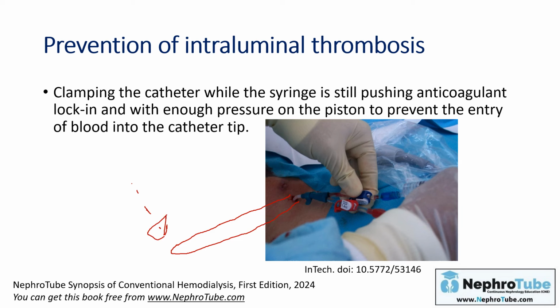You can have clots at the tip of the catheter here, and this may result from poor catheter care, because at the end of treatment, care must be taken while locking the catheter with the anticoagulant lock to prevent backflow of blood to the tip of the catheter.